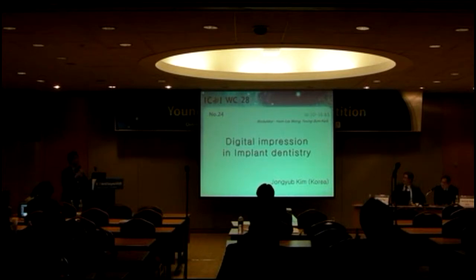Again, with all the external hex implants, like the traditional one, you can make a digital impression. Also in Europe, the Cadent iTero is distributed by Straumann. I don't know about Straumann, but they may have this kind of option too in Europe, not in Korea.